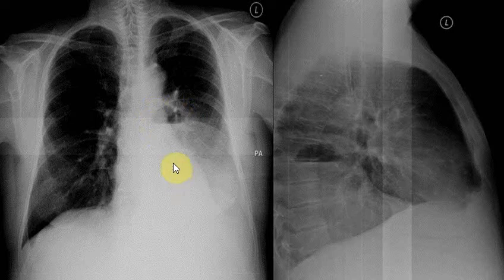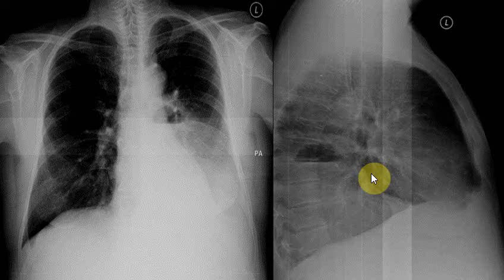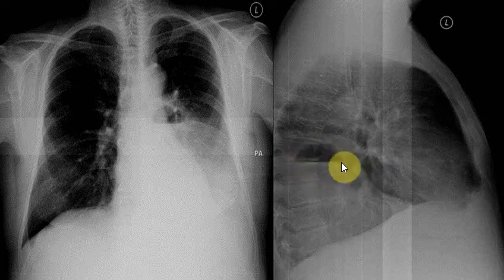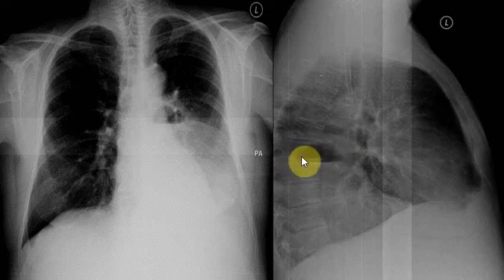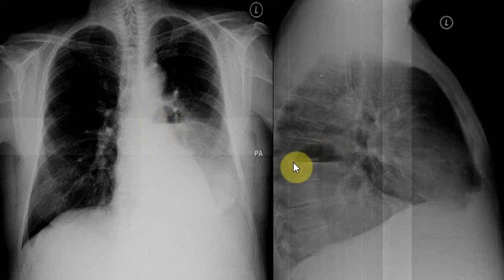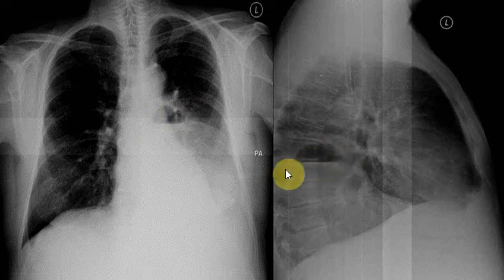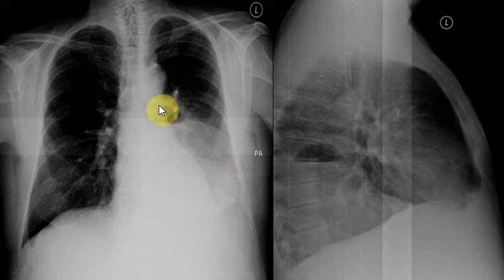This is a PA (posterior-anterior) view, and this is a lateral view from the left side. We can also see here that this structure is present — it looks like a moon shape, but it is actually a circular structure with an air-fluid level. When you see a structure like this, most of the time it represents an abscess formation.